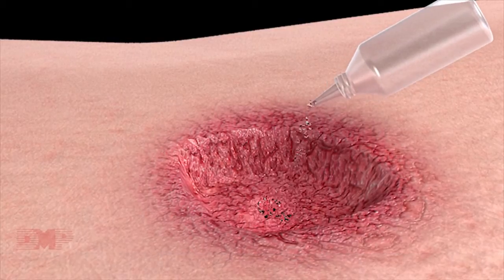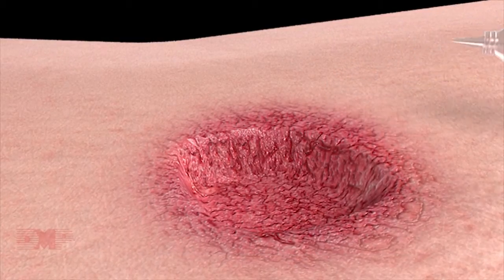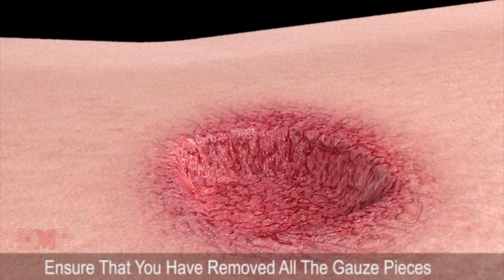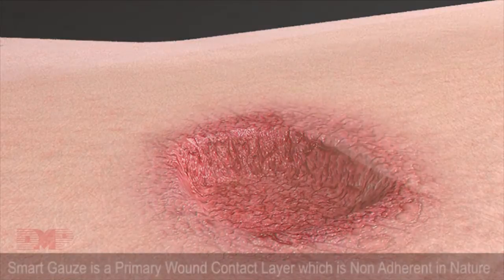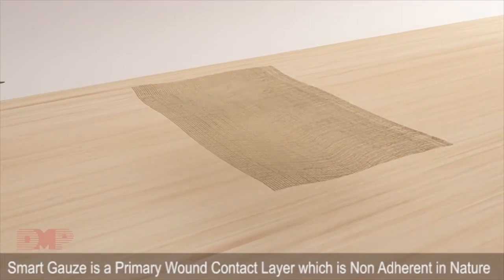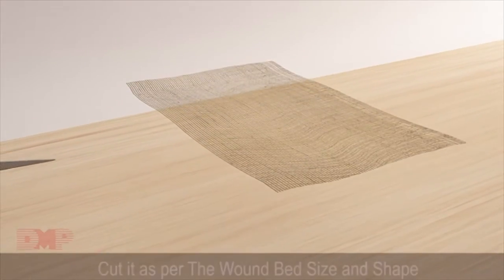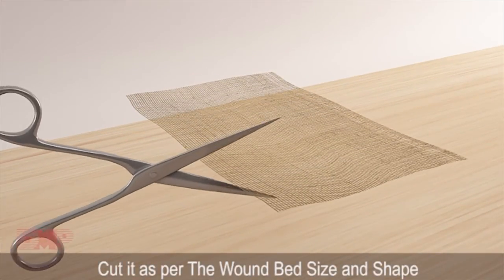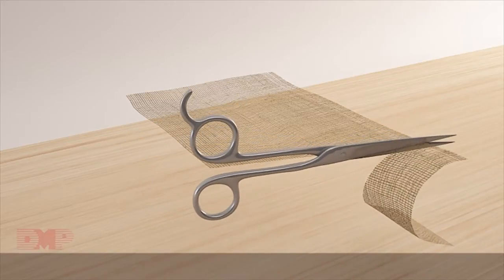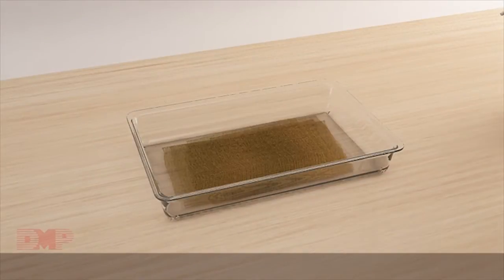If you are performing a dressing change, be sure to identify the number of gauze pieces previously placed in the wound. Ensure that you have removed all the gauze pieces. Smart Gauze is a primary wound contact layer which is non-adherent in nature. Cut it as per the wound bed size and shape. Do not cut the dressing over the wound as this could result in threads from Smart Gauze falling into the wound.